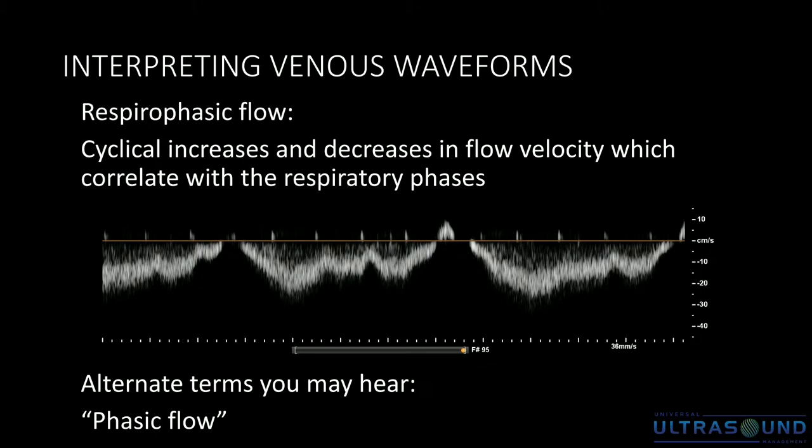So I'm here to show you that you can visualize these patients, right? You can see this, even in the most difficult patients. Patient positioning can help, and maneuvering your transducer can help as well in different aspects of the abdomen. But our goal as sonographers, right, is to answer the clinical question.